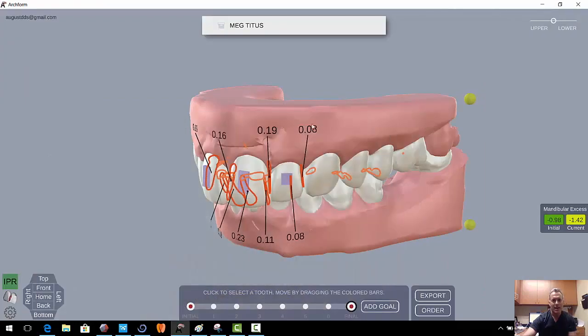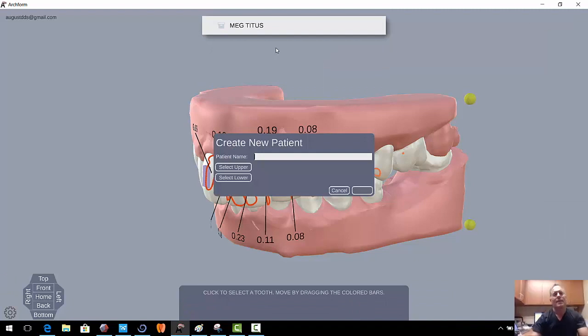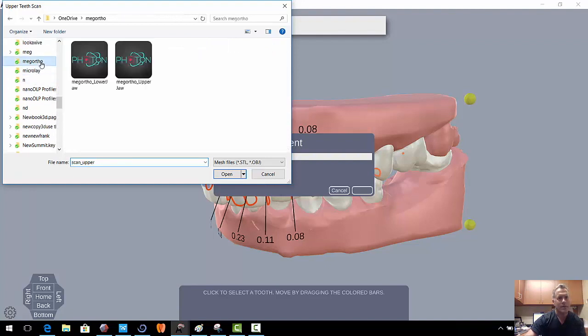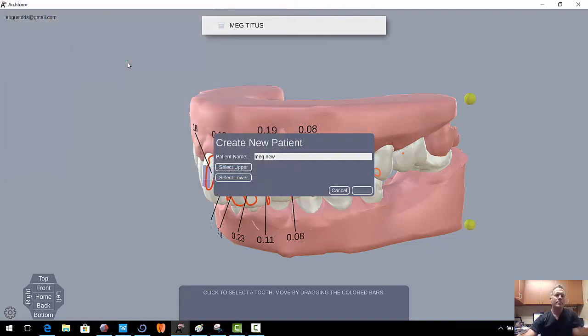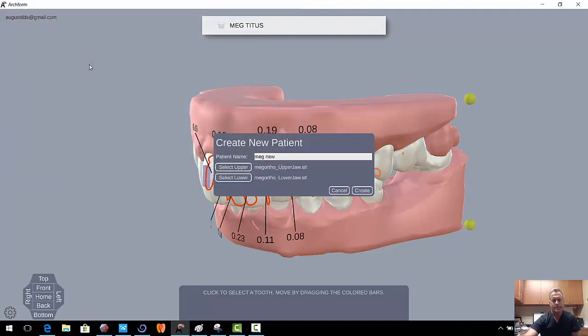So we'll go ahead and set up a new patient. And her name is Meg. So let's call that Meg New. We're going to enter in our STL files. So I've saved these under Meg Ortho. So we've got our upper, got our lower, and we hit create.